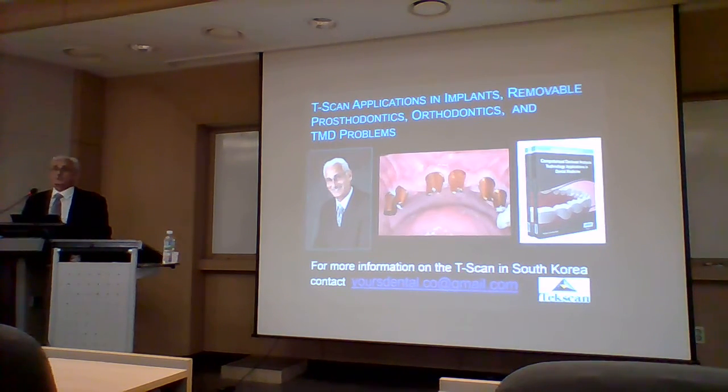There's nothing that competes with the T-scan. I think because it has had such a struggle to regain acceptance, no one else has wanted to build one. You know, of all the digital tools that you have available to you, it's been the most resistant technology, and yet it's the most helpful technology from a practical standpoint, because everything we make, from fillings to implants against implants, there's an occlusal adjustment phase, right? If you do a quadrant of composites, there's an occlusal adjustment phase. If you do a single crown, there's an occlusal adjustment phase.